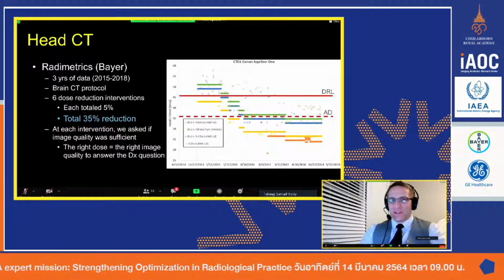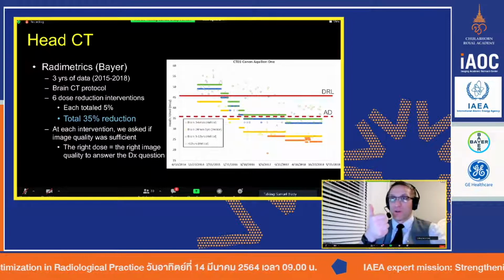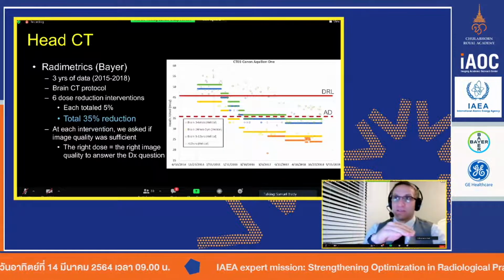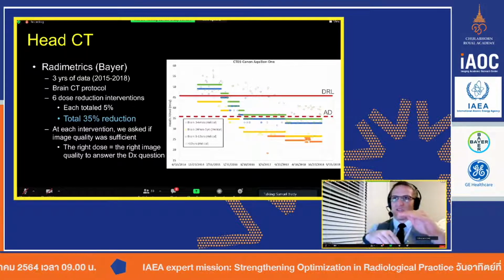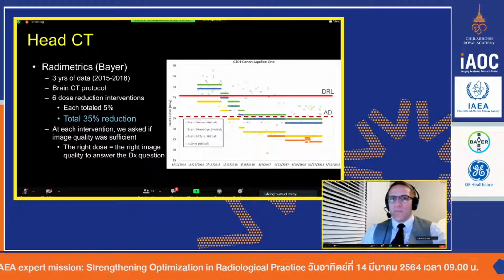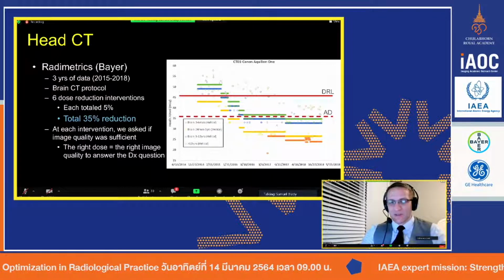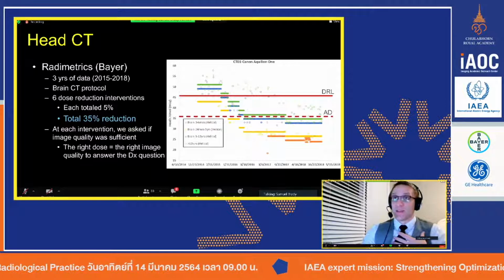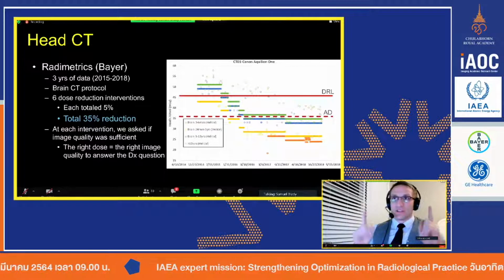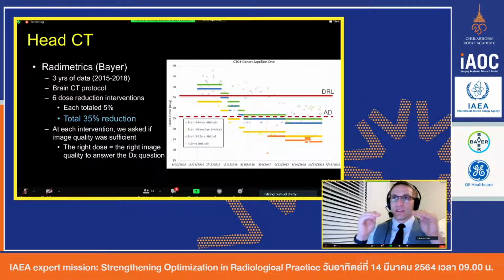Yep, that's a great point. When you look at this, the kV is basically set for image quality, for the contrast, so good gray-white differentiation and penetration. Just like you said, basically under 2, you're 100 kV, over 2, you're 120 kV. It's a rule of thumb. But to go from this step, this CTDI value here, down to this one and to this one, because we used fixed mA, all we had to do is just turn our mA knob down. That's simple.